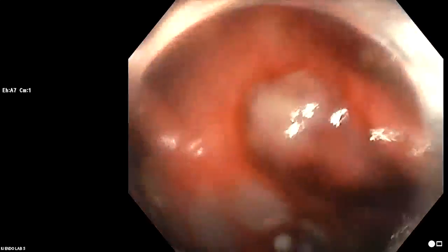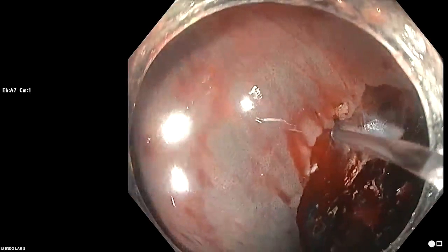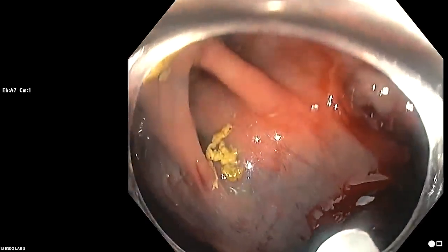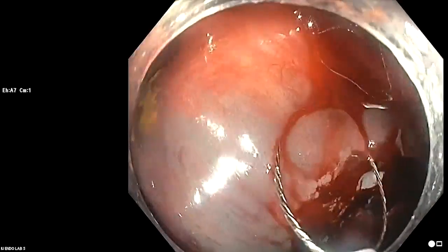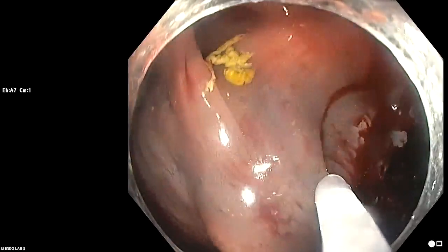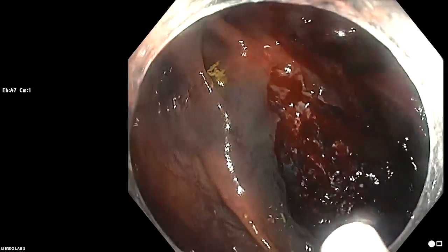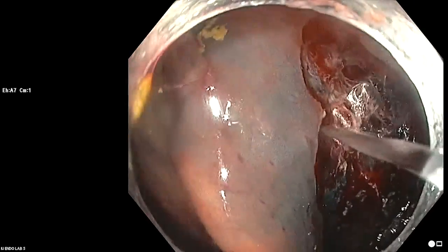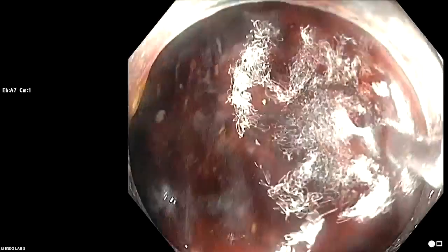But you know, in terms of small polyps, we saw the recent randomized controlled trial from Australia that indicated that the most important thing in terms of a complete resection when you're removing a small polyp is to place the snare accurately, so that you get a nice rim of normal tissue around the polyp.